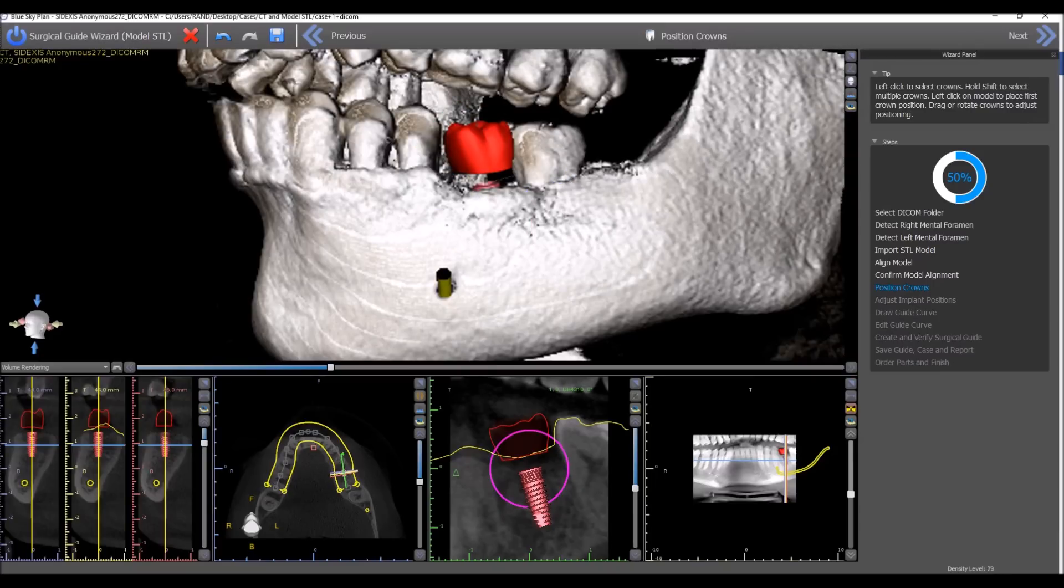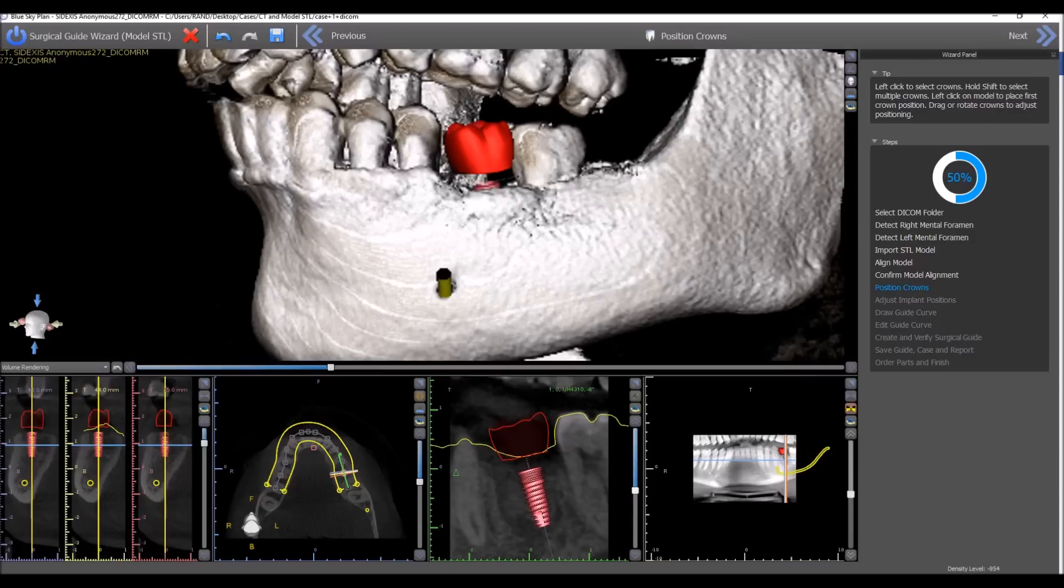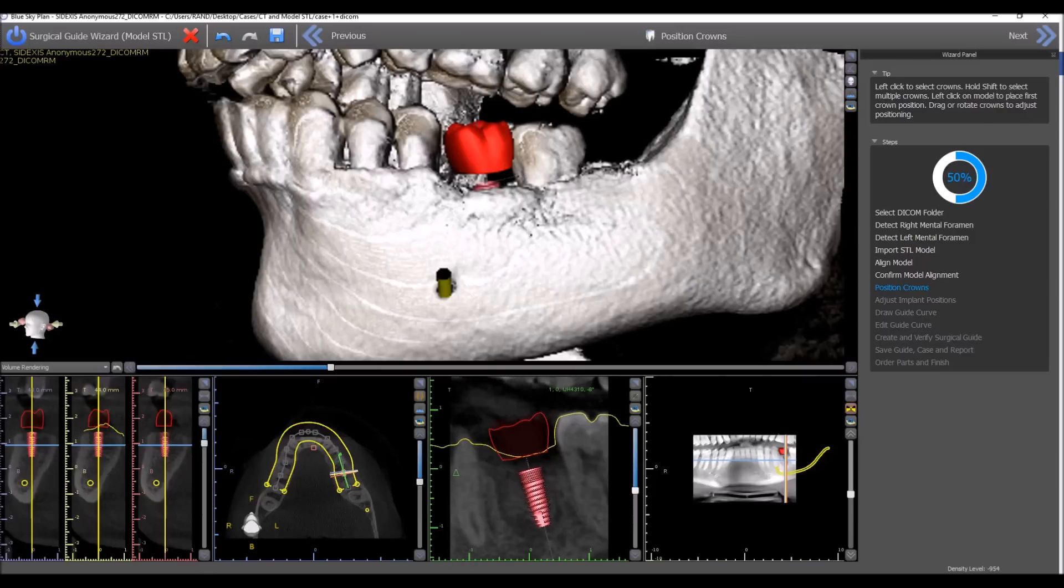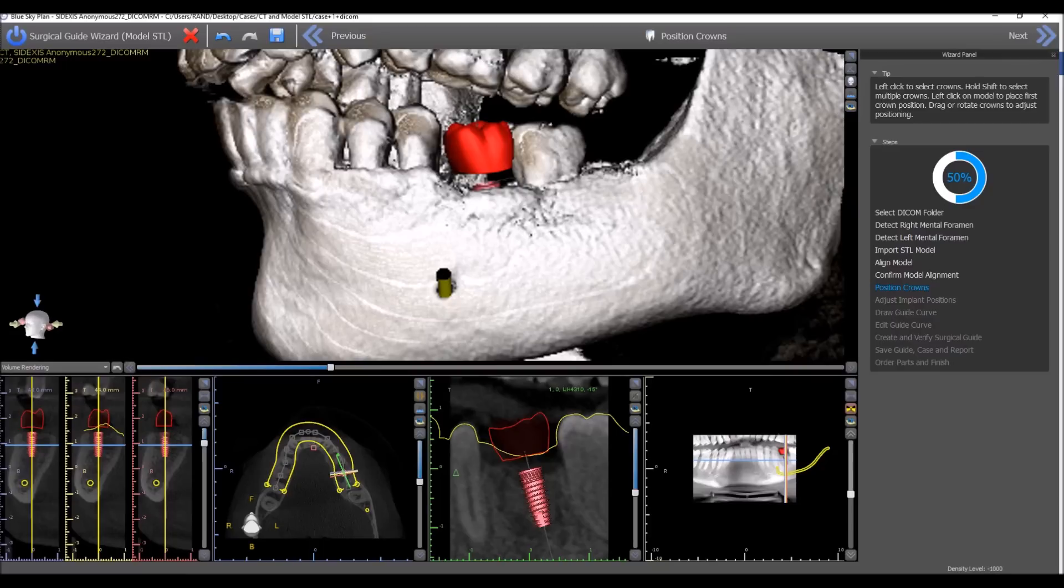While we're looking at our tangential view, the tangential view will show us 360 degrees around our implants. Let's discuss another improvement that we have with the tangential view.